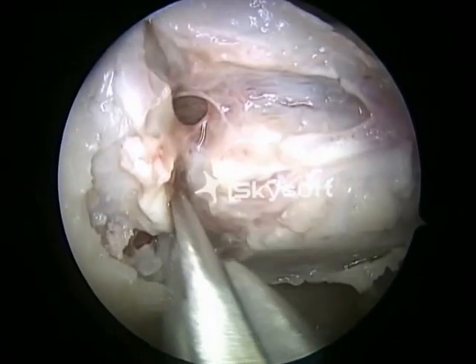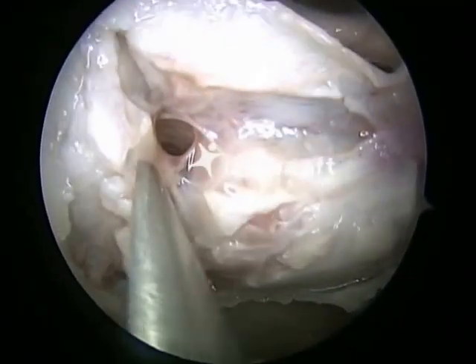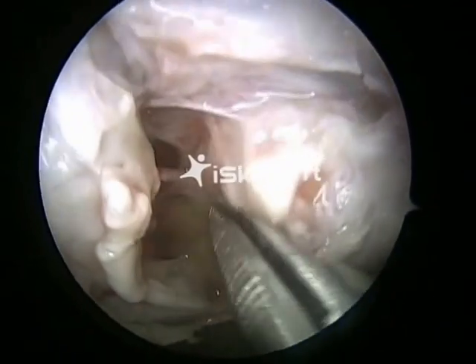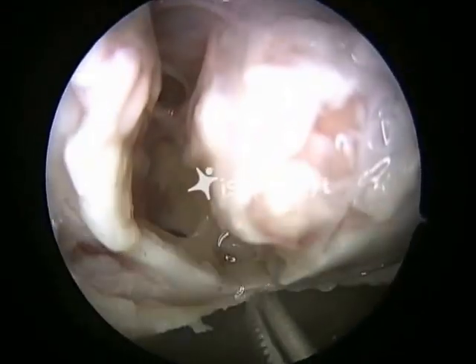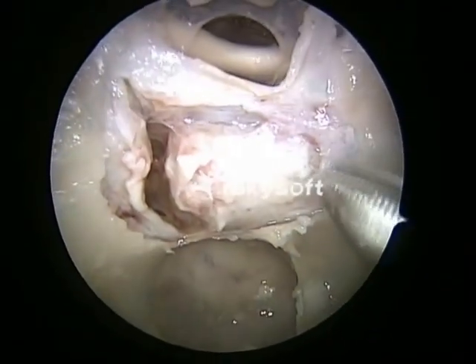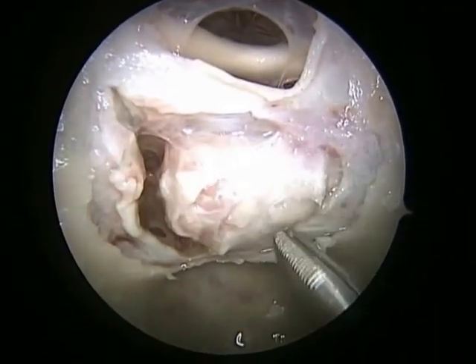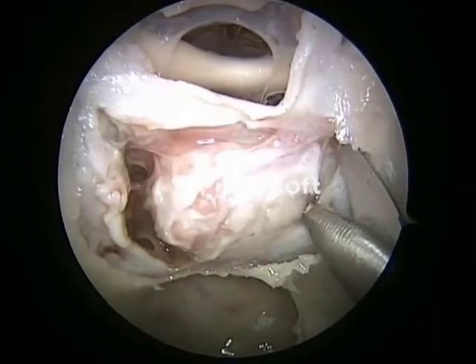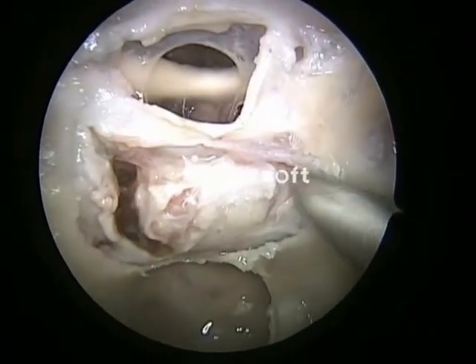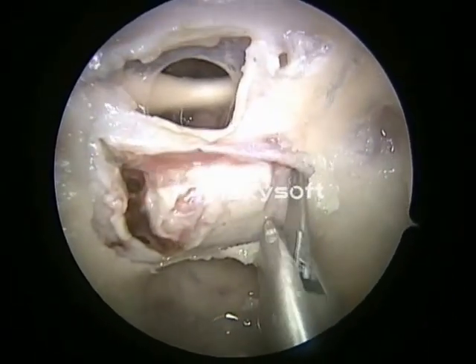The pituitary gland is suspended laterally by trabeculae, and that plane is a very important plane, and we can dissect that gland out and you can see the plane very nicely. And this is where the inferior hypophyseal artery will be there. And the same is done on the left side as well. The subdural dissection is done. The dura has to be dissected all 360 degrees for us to transpose the pituitary upwards.